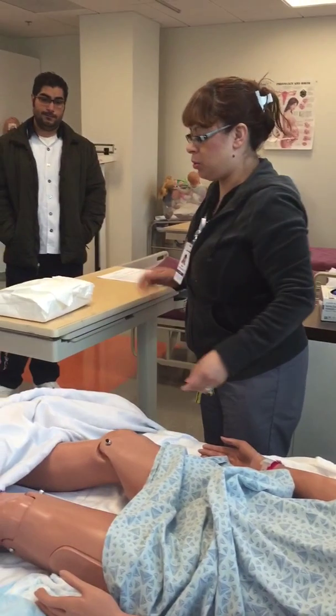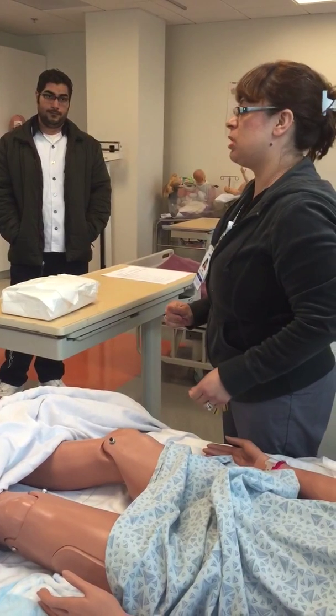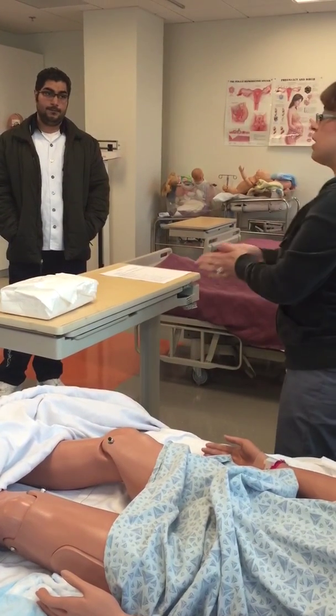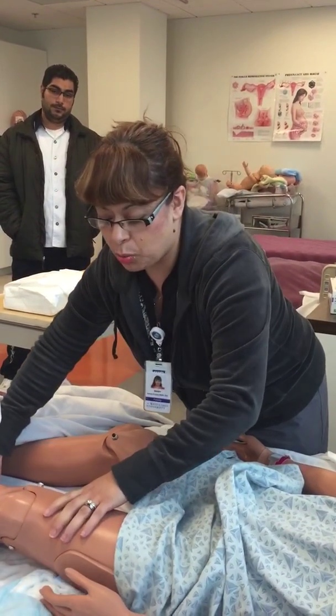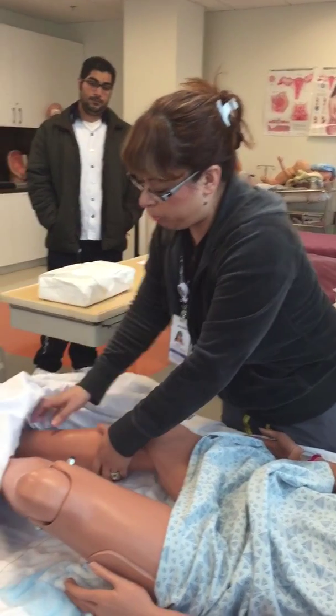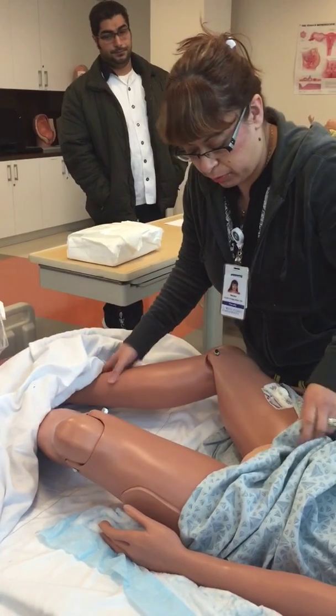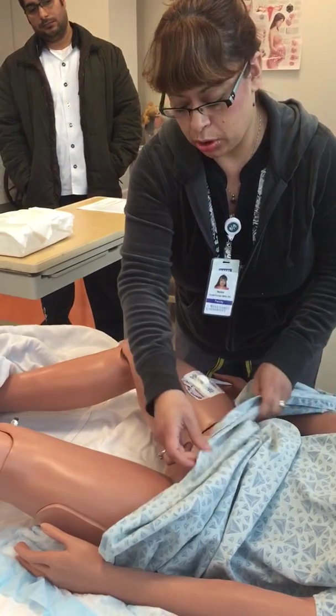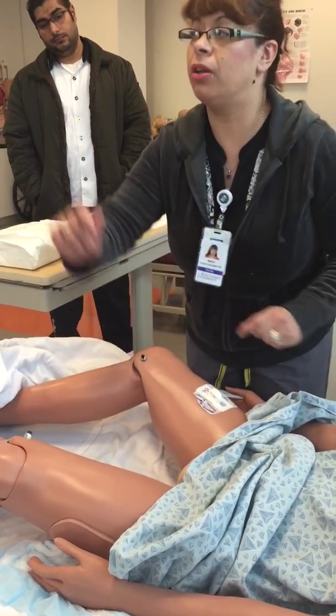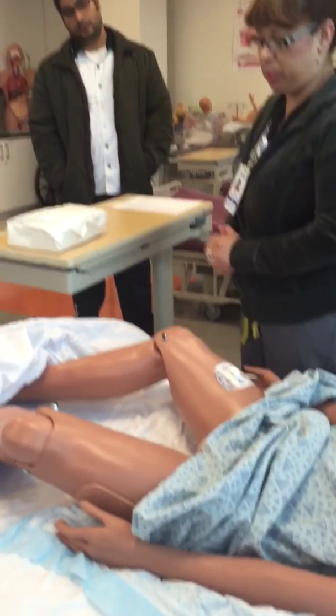Because I don't want to turn my back too much to my sterile field, I'm going to go ahead and position the patient now. You can put gloves on again depending on your comfort level. You already hand sanitized again, and you want to instruct the patient to open her legs like she's getting a female exam. Since you have her exposed, you want to make sure that your curtain and everything is closed to provide her privacy.